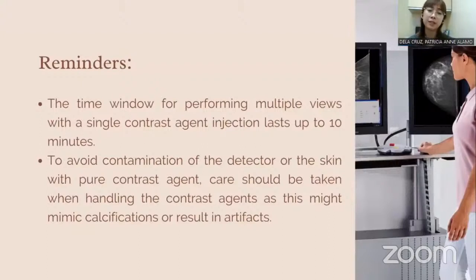So to avoid contamination of the detector or the skin with pure contrast agent, care should be taken when handling the contrast. It should not be splashed or dropped on the patient's breast because it might mimic calcifications or result in artifacts that can lead to false results or repeat examination.